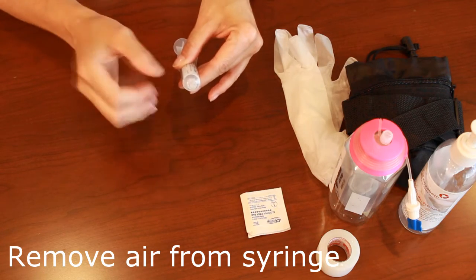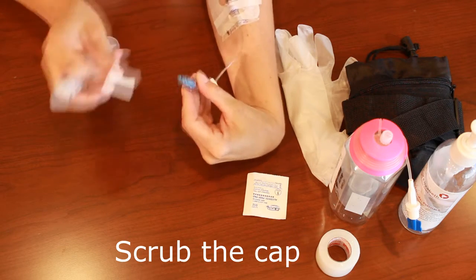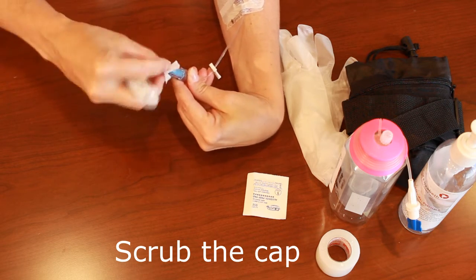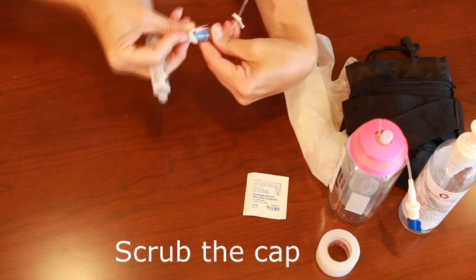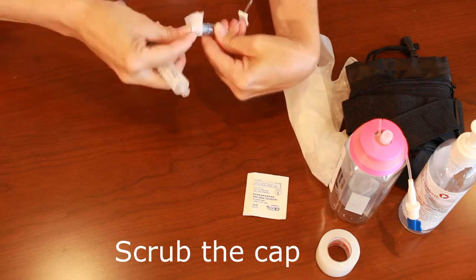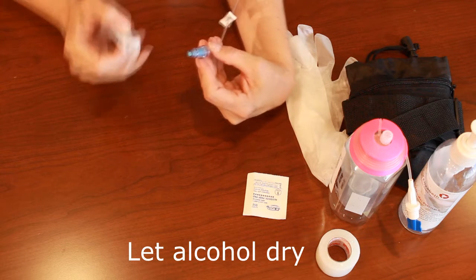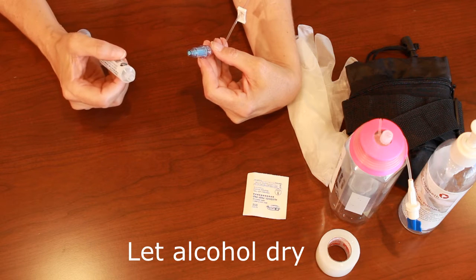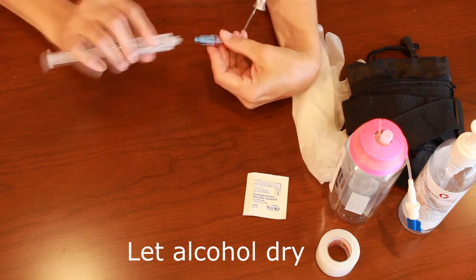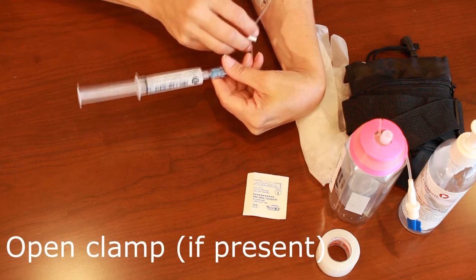It's critical that you do not touch the open end of the syringe. Take your alcohol pad and scrub the cap on your vascular access device using friction — you should be scrubbing for 15 to 30 seconds, making sure you get the flat end as well as the threads on the side. Be aware of where the open end of your syringe is so that you're not contaminating it. Discard your alcohol pad and allow the alcohol to dry — typically wait 15 seconds. Do not blow on the cap or wave your arms to hasten the drying. Attach the saline syringe by pushing in and twisting to the cap. Open the clamp if it's not already open.